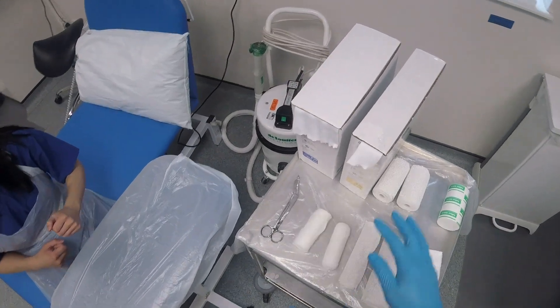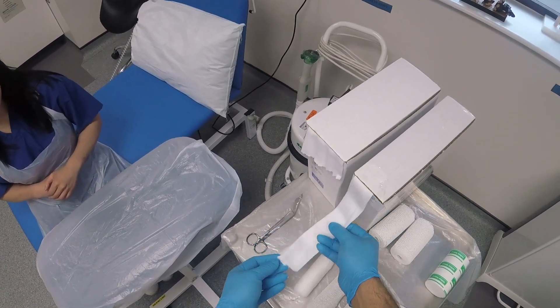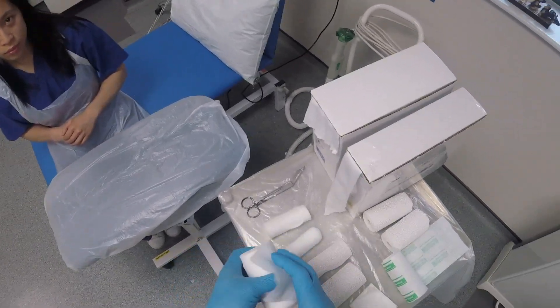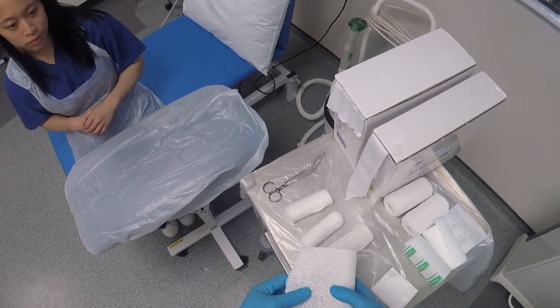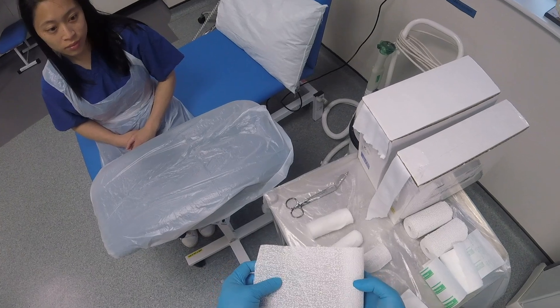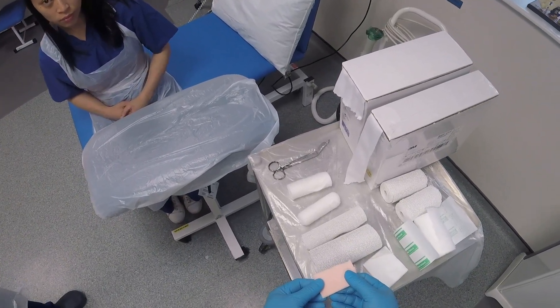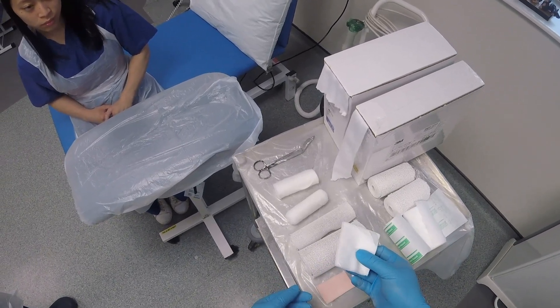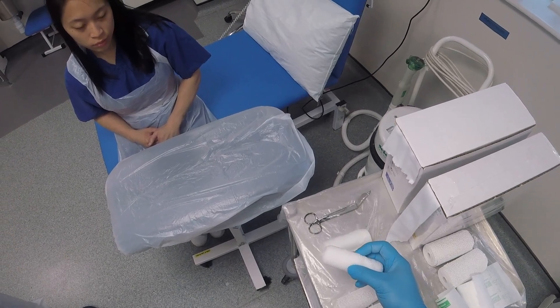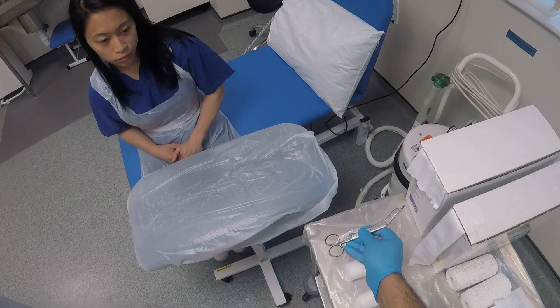First of all we're going to check our materials. We've got stockingette, which is a comfort layer — not everybody will have this available. The second layer is plaster wool, which protects the skin from the plaster. Then we're going to use some plaster, which is on a roll. We've got felt to protect bony prominences like the ulnar styloid — if you don't have felt, you can apply gauze instead. We also have a crepe or cling bandage to bind around the plaster and hold it together, and a good pair of scissors that can cut through plaster.